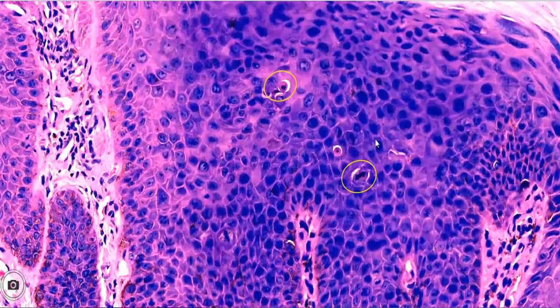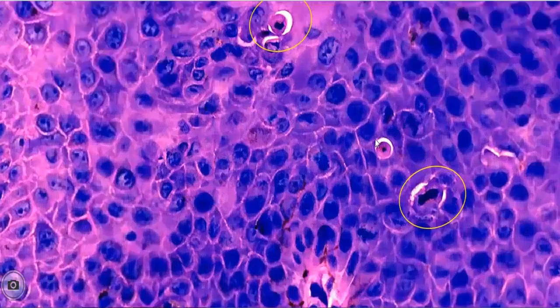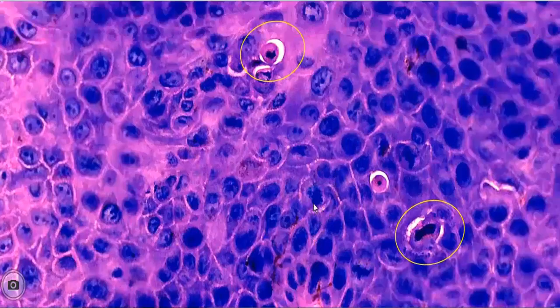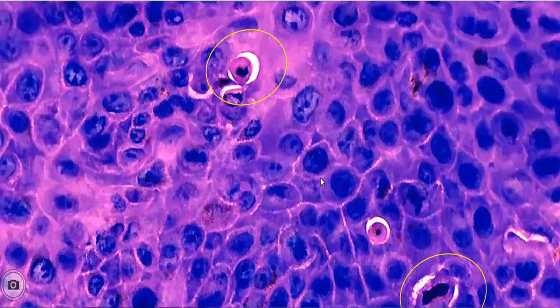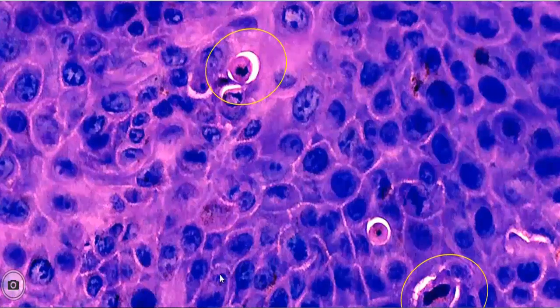Another high magnification view shows abnormal mitotic figures situated at various levels in the epithelium.